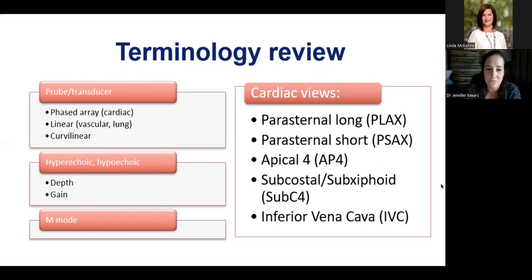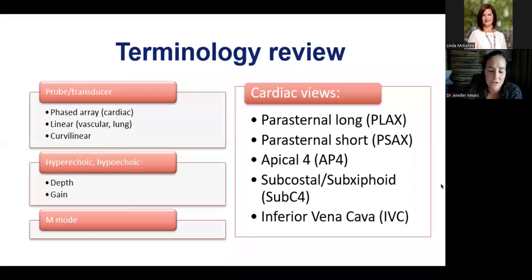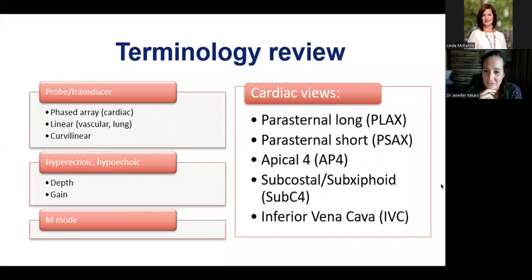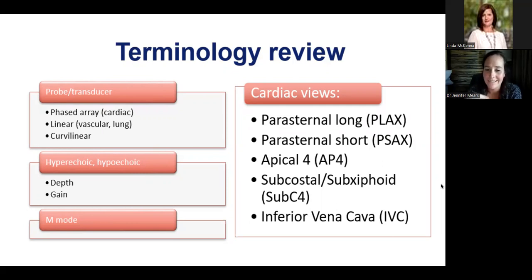Hypoechoic refers to structures that are dark on screen. Depth really just determines how deep into the body you're looking — very superficial depths when placing lines versus deeper depth when looking at intrinsic organs. M-mode is a specific type of ultrasound mode that helps us look at a single point in an anatomical structure over a period of time. We'll look at what clinical implications that has, and we're going to go into the various cardiac views in just a little bit.